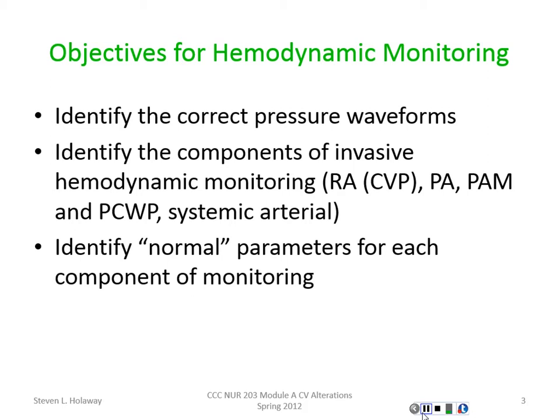More of you will see the systemic arterial lines than you will actually see a SWAN line. SWANs have kind of come and gone out of vogue. Back when I was working CCUs many years ago, they used them quite extensively. They have found that basically with good observation, good nursing care, and good physical assessment, that we can tell about as much about the patient as we need to without having to do that invasive SWAN line. So in CCU, you see them rarely now.